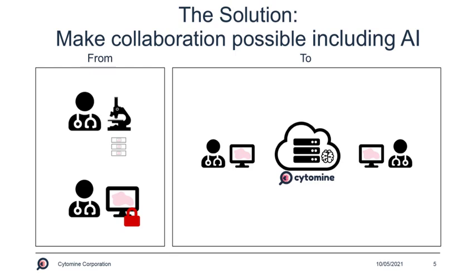Due to these limitations, it's quite easy to understand why digitalizing the slides was not sufficient to enhance collaboration between pathologists, as sharing these images over the internet was really a challenge. But if Google succeeds in sharing images of the Earth using Google Maps, why not try to use the same kind of technology to share digital pathology images?